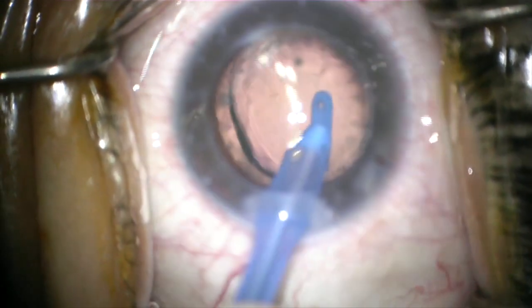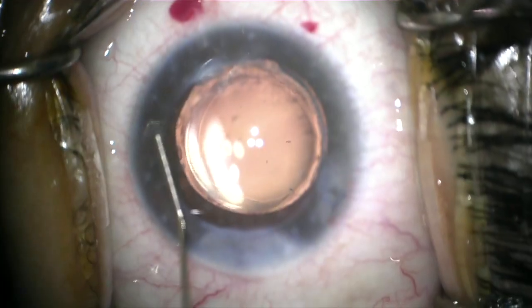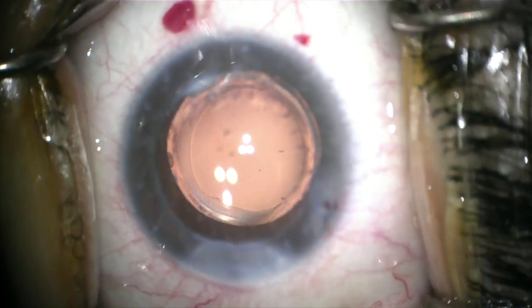Wound closure is also an important consideration. Because you've tried to stay away from the graft edge, you need to make sure that these wounds close very well. If needed, you can employ tissue sealant or a corneal suture.